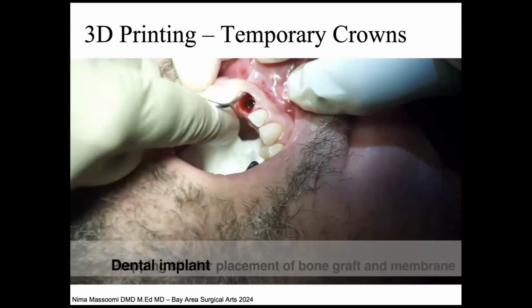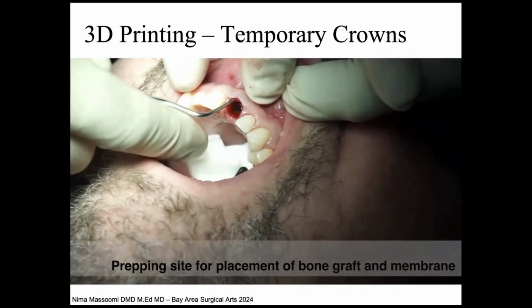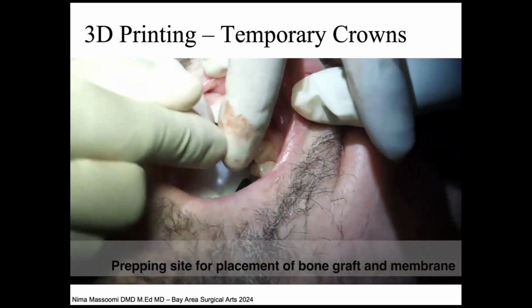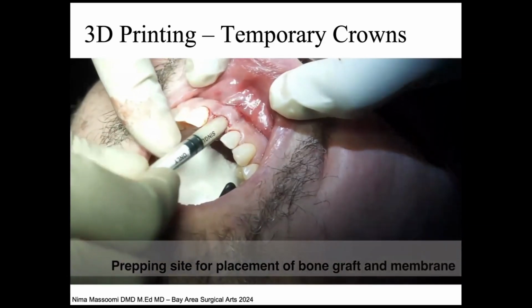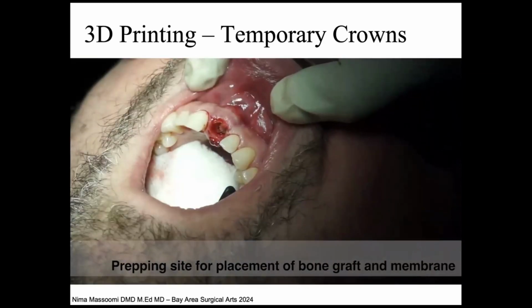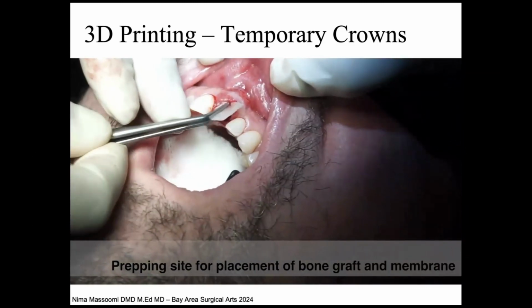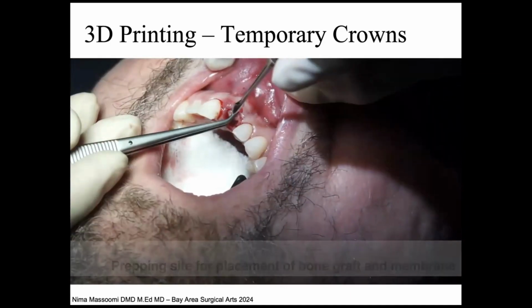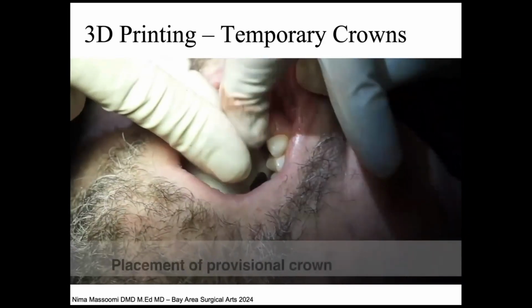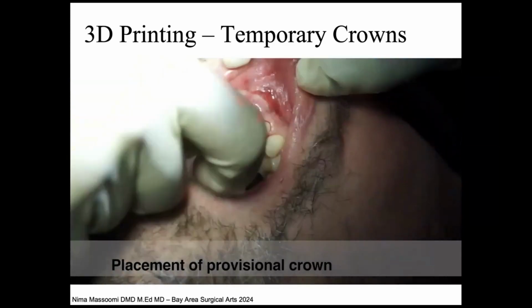This is us after we've placed the implant. Now I'm getting ready to do our bone grafting. A lot of people ask how we do this, which is why I wanted to make sure we have this in this video. We put a cover screw on the implant itself, and you can see that we inject that material buccal to the buccal plate, okay? And then on top of that, as I'm going to show you a little bit later, we're going to put a resorbable membrane. It's just another extra layer. He's not a thin tissue biotype patient. He's got very thick attached gingiva, but in all of these cases, I like to always bulk up the buccal aspect.